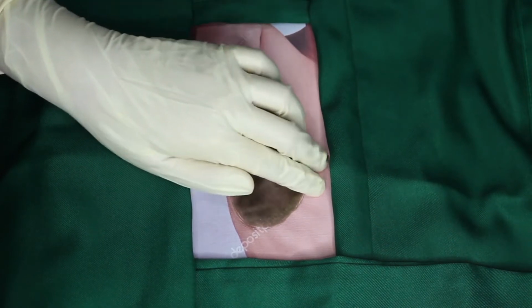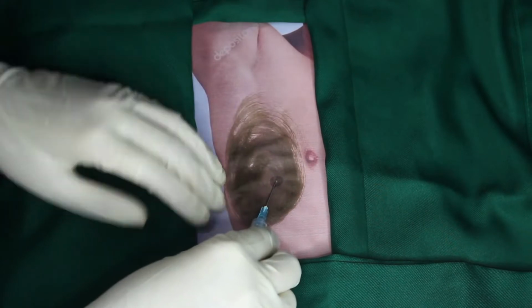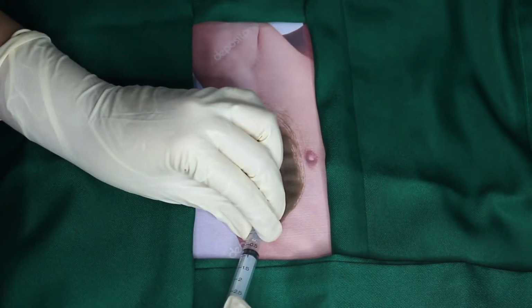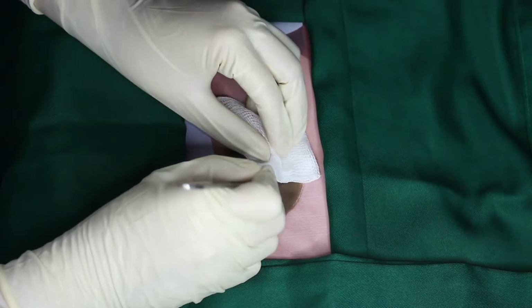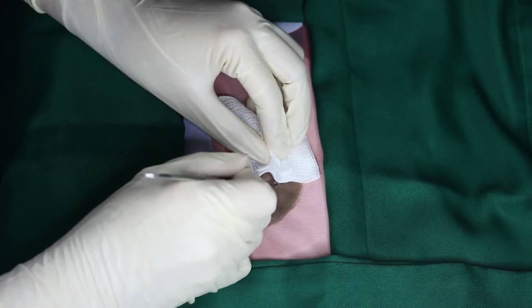At the 4th or 5th intercostal space, anterior axillary line, infiltrate the skin with a local anesthetic and block the intercostal nerve branches. Do not forget to infiltrate the pleura. Make a 2.5 to 3 cm long skin incision well into the subcutaneous tissue.